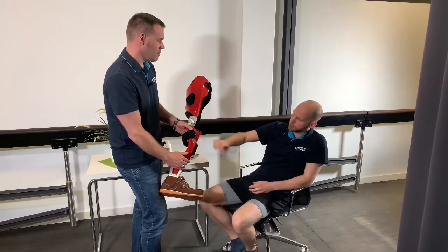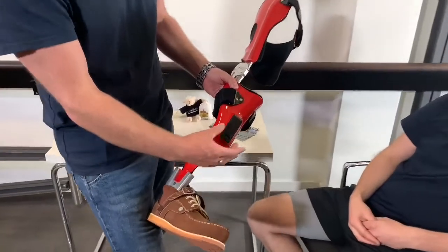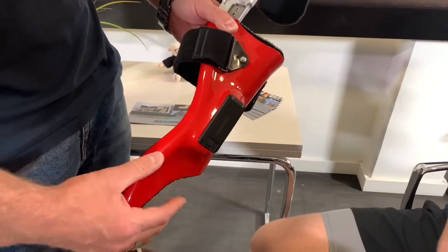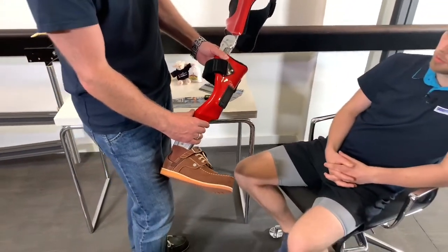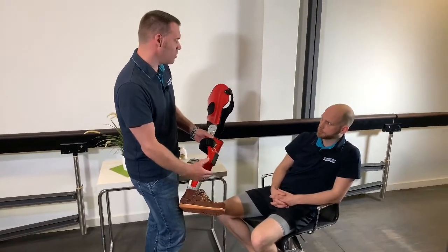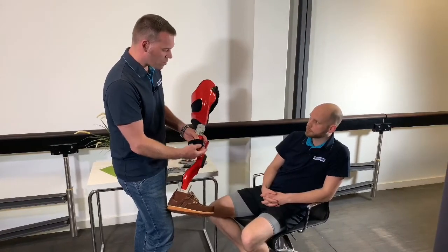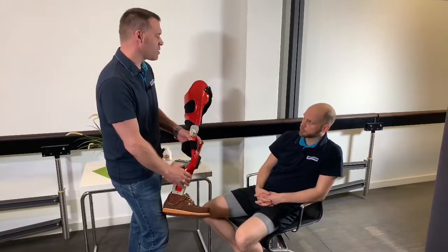It is controlled electronically and measured through this black box here. Exactly — this black box is the controller, the battery is built into it, along with a whole series of sensors that measure the course of movement and thus know when your swing phase takes place. If the battery of the controller is empty, the worst thing that can happen is that the joint remains locked. The Neurotronic needs battery power to open, and if the battery is empty, the joint will remain locked.